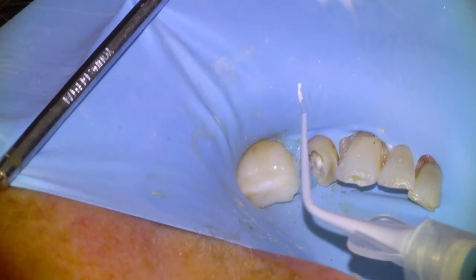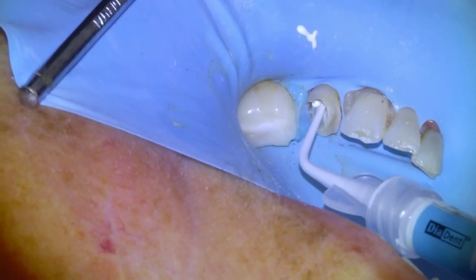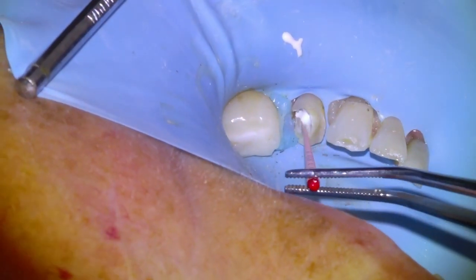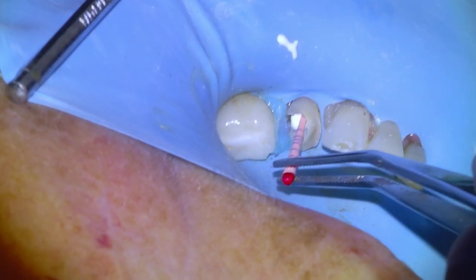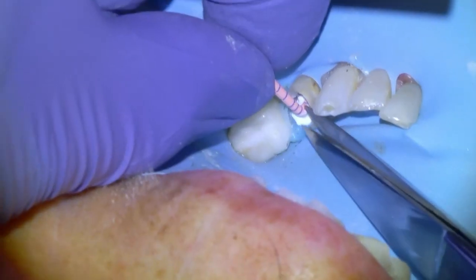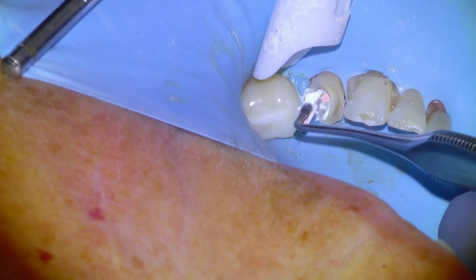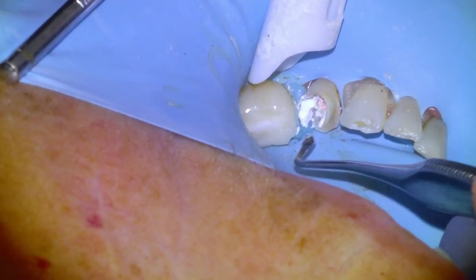We'll take our sealer and begin placing it as apically as we can into the canal. This is Diadent BioSealer, which is a bioceramic sealer. Then we'll take our master cone, tamp down the sealer material a little bit, and then place it to length. Snip the excess and then sear off the coronal portion down to the orifice with a heated plugger, just like in dental school.